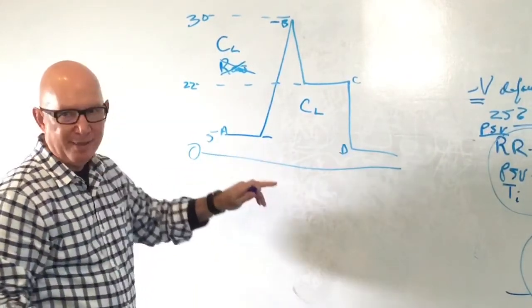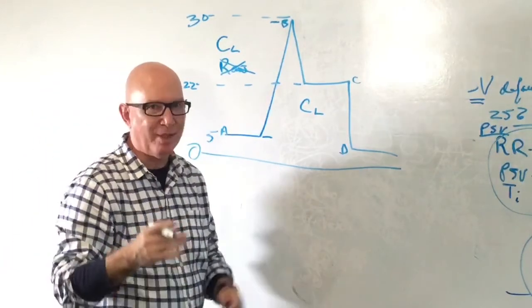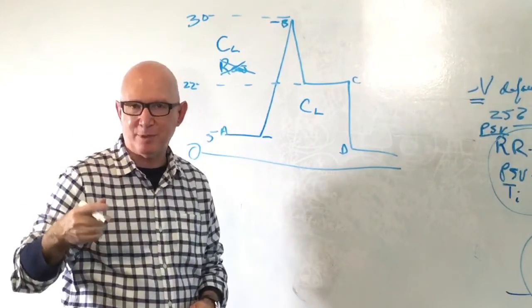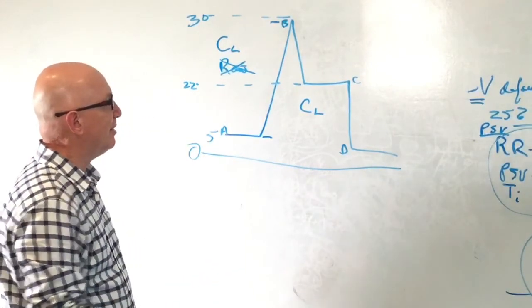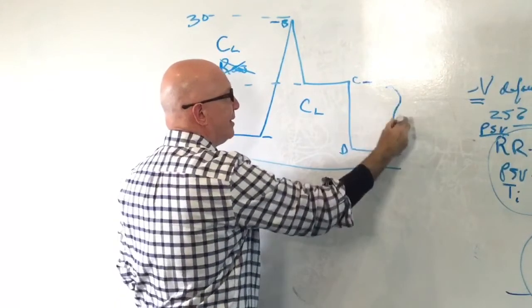The literature today, and I should be careful when I say the literature today, because there are people that may have read this earlier and have been thinking along this line for driving pressure for much longer. So, and then I'm really demonstrating the fact that I'm out of touch on this piece. The literature today, though, actually uses driving pressure as this pressure here.